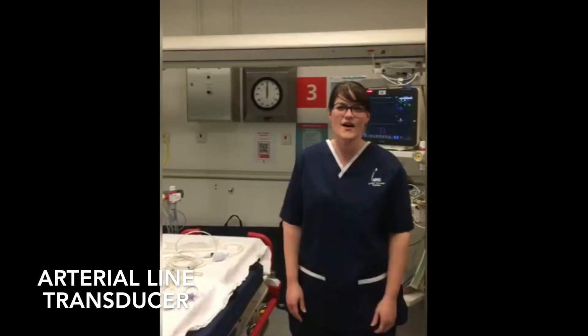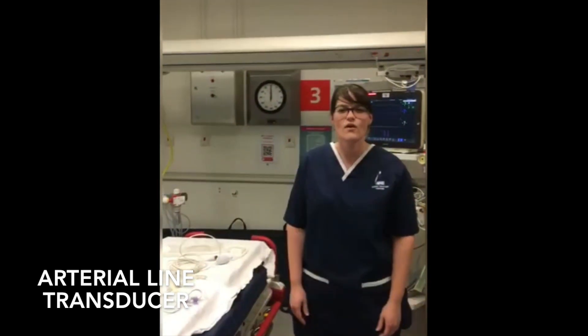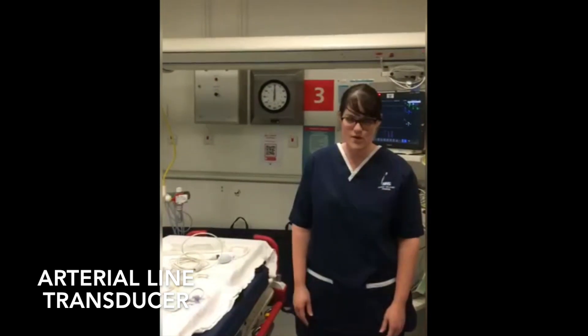This is a short video on how to set up an art line kit, the equipment you will need, and how to zero a line.